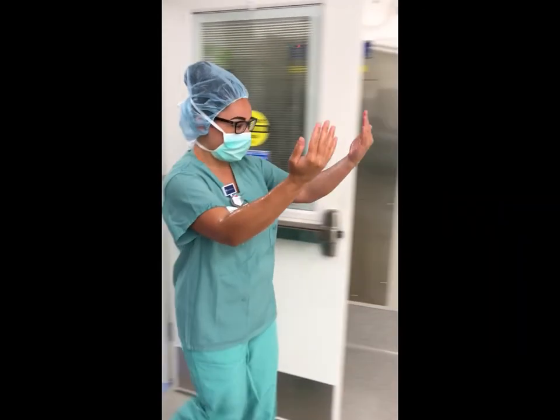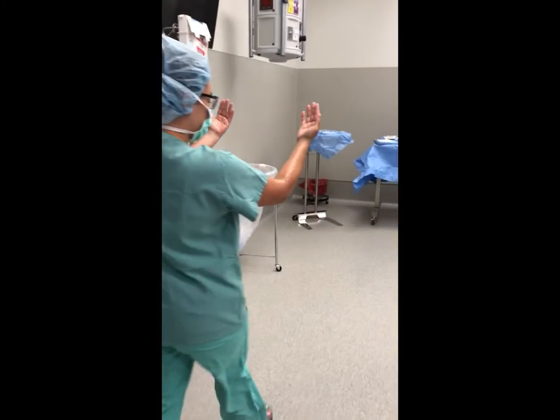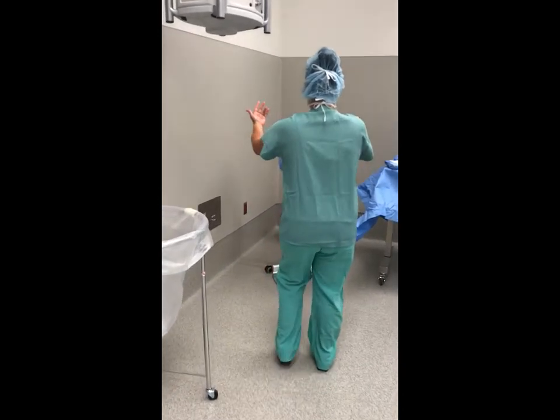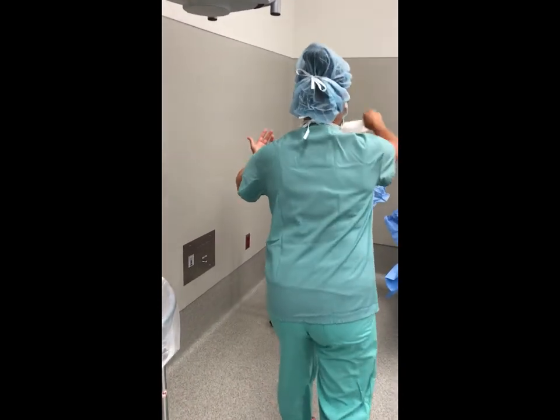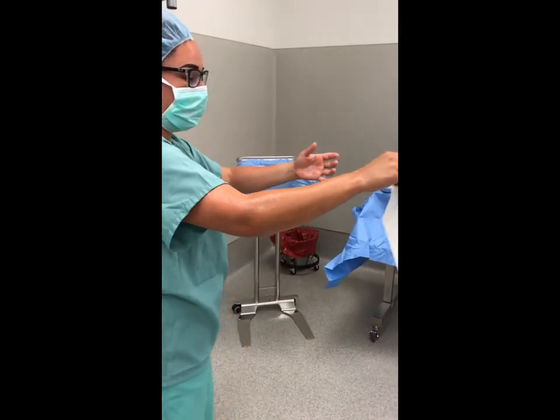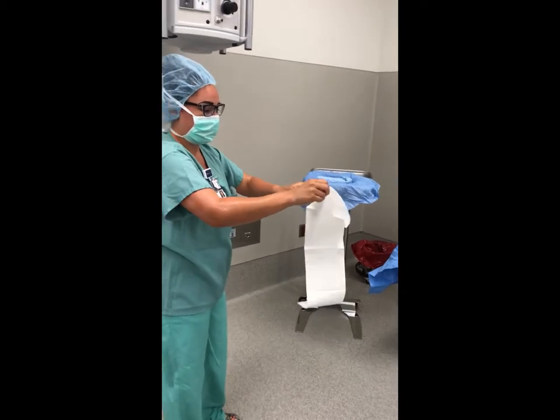Prior to scrubbing in, open your gown and gloves on a flat surface away from the sterile back table. Grab the towel near the open corner and lift straight up and away from the field without dripping contaminated water from the skin to the sterile field. Allow the towel to unfold downward to its full length and width.